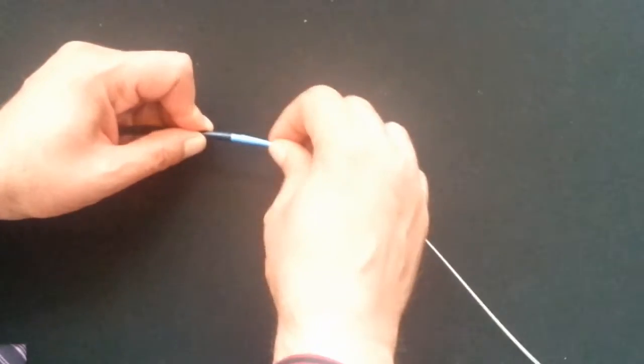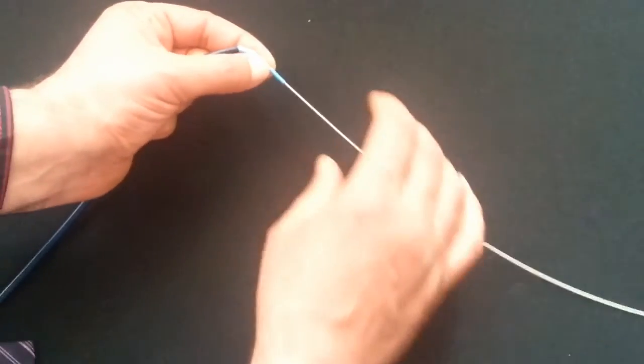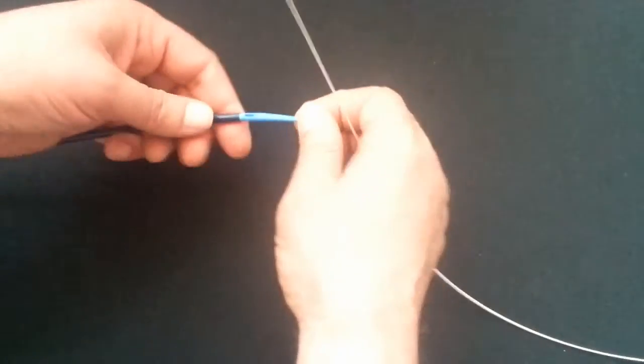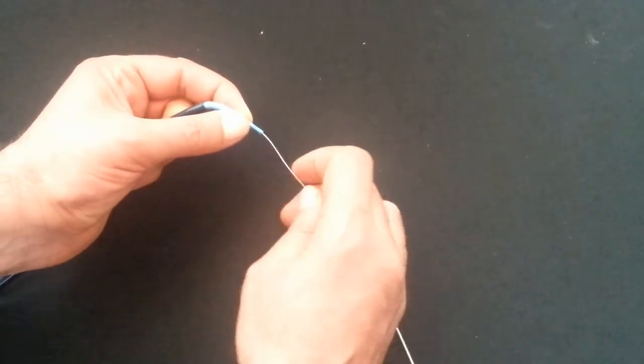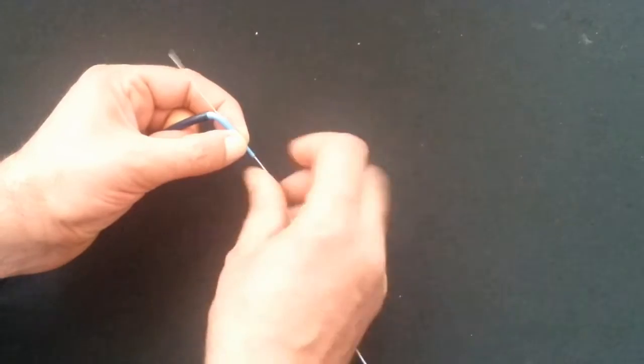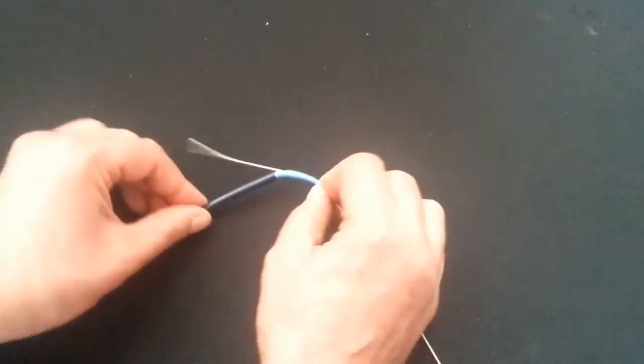The tapered dilator is curved. The egress hole is in the apex of the curve. The guide wire exits the dilator smoothly and quickly.